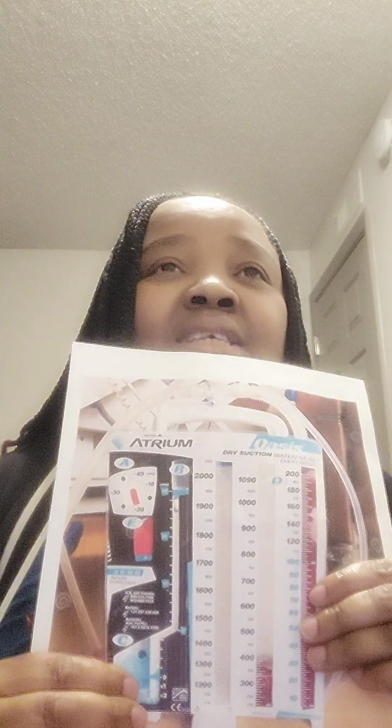Then another thing to note is when troubleshooting, when you want to find out where the air leak is coming from. For instance, if this is the tubing here, this is attached to the patient. Let's say this is the chest tube site. So what you do is that you want to know along this tubing, where is the leak coming from. The first thing you should do is check all the connections.